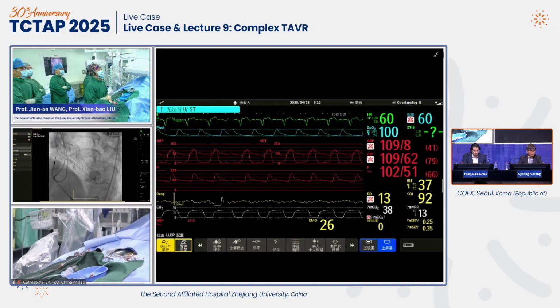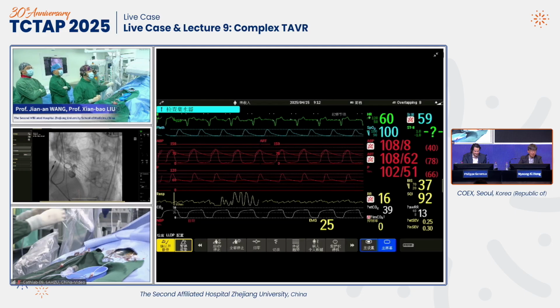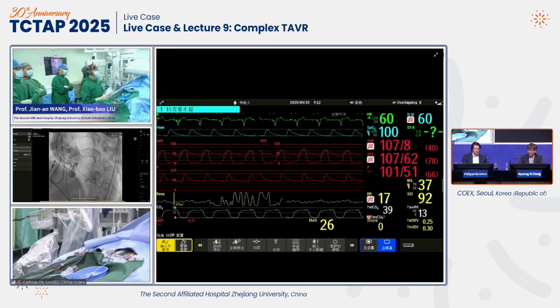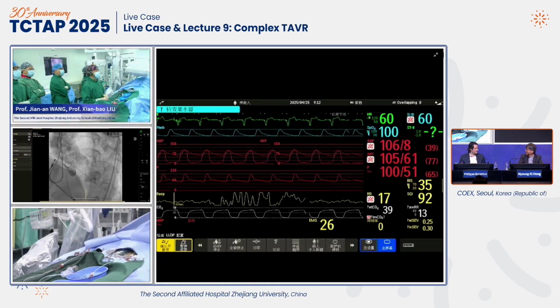Thank you so much for your very good suggestion for the second valvuloplasty and selecting 26. Thank you so much. We have remaining time. We'd like to discuss more about these cases.